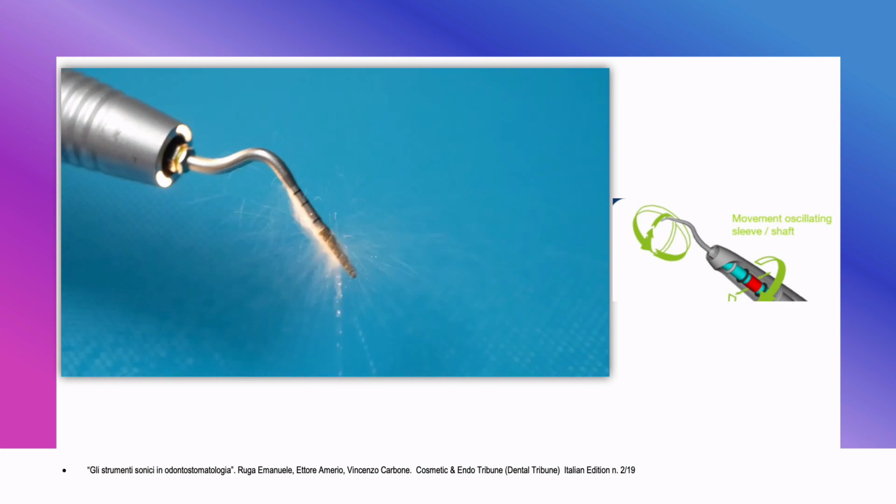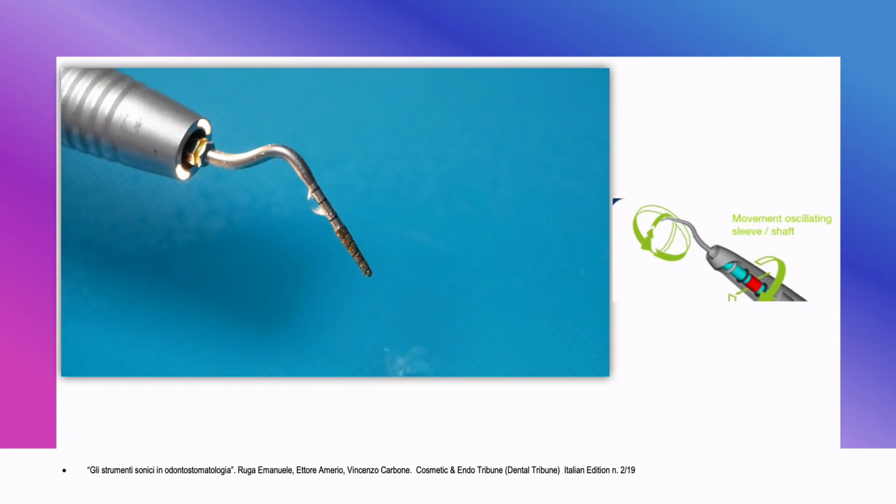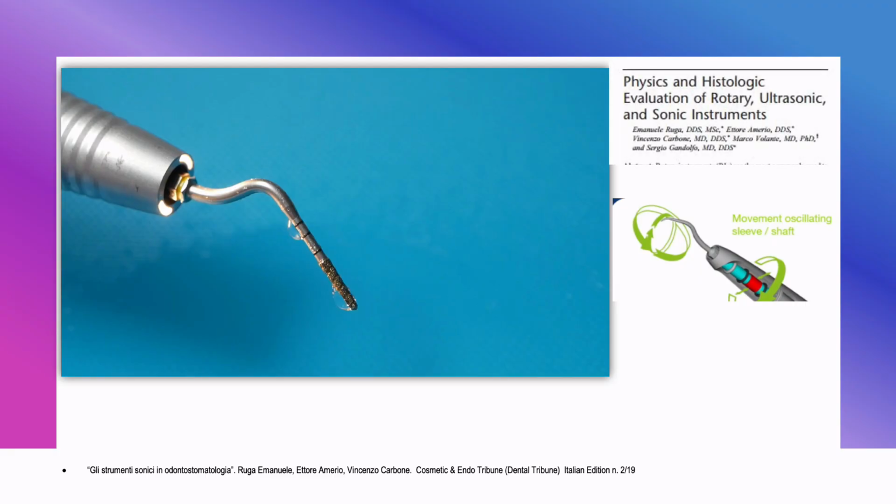Sonic instruments have been recently used in oral surgery and in many fields of dentistry. These instruments share many advantages with ultrasonic handpieces and can be connected to the dental unit easily because they work by means of compressed air. Their frequency ranges between 5 and 9 kHz, and thanks to this compressed air, the tip can oscillate between 100 and 250 micrometers in space, providing a selective, precise, micrometric cutting action.